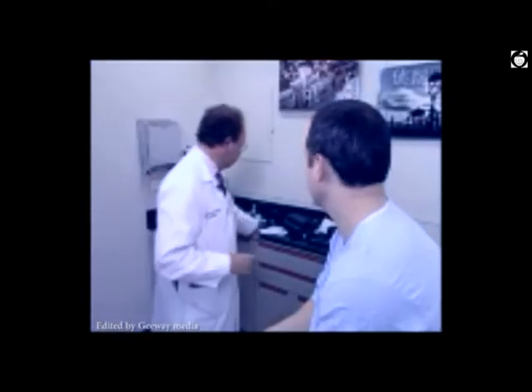Mr. Johnson, we're going to start with assessment of your vision. Visual acuity is determined by either a wall-mounted Snellen chart or, very commonly, a pocket Snellen chart, as I have here. Mr. Johnson, would you take your right palm and place it over your right eye? And I'm going to hold this about 14 inches in front of Mr. Johnson's left eye. And could you read the smallest line possible?